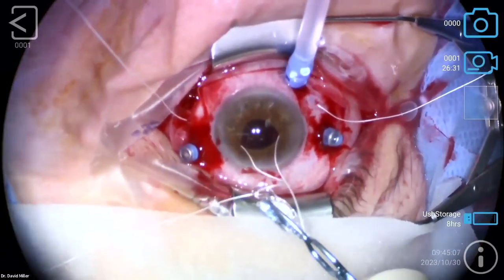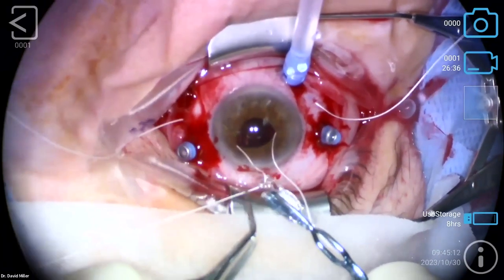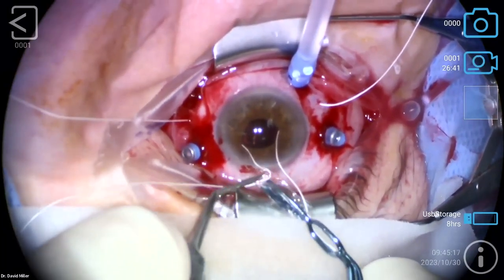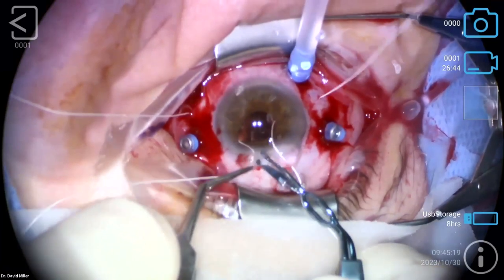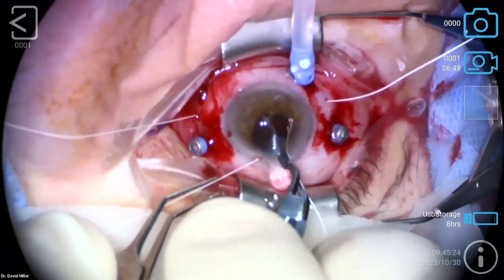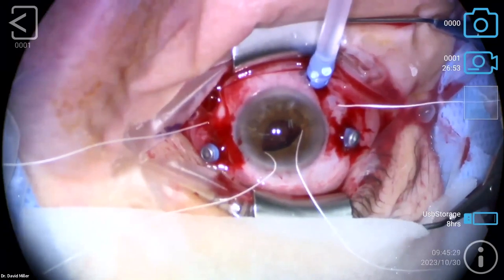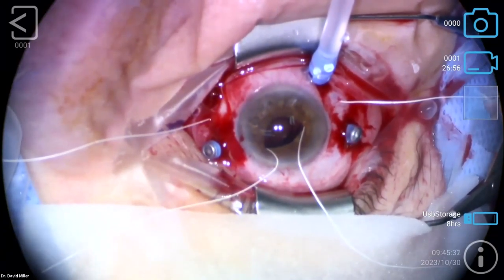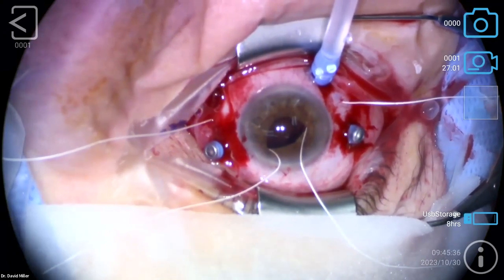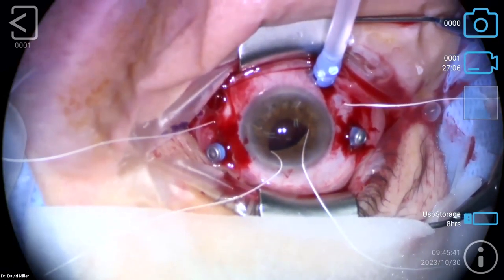You get the McPherson there again for me. And so what we're doing is keeping those sutures a little tight compared to the video. There we go, in the eye. They're pulling up on the sutures, I'm releasing, and that saves the tangling. So now you can see the one haptic still in the anterior chamber, I'm just going to push that back with the super grip there, just to get the lens completely into the posterior segment.